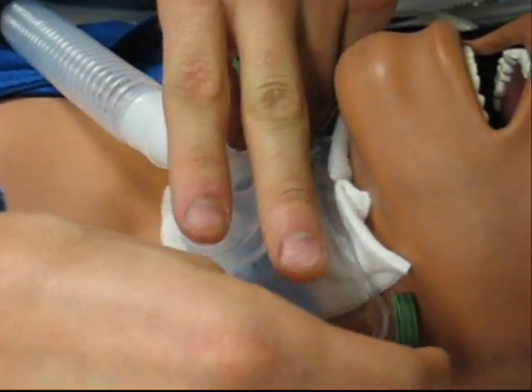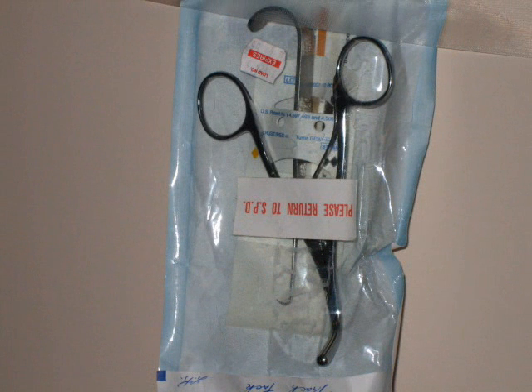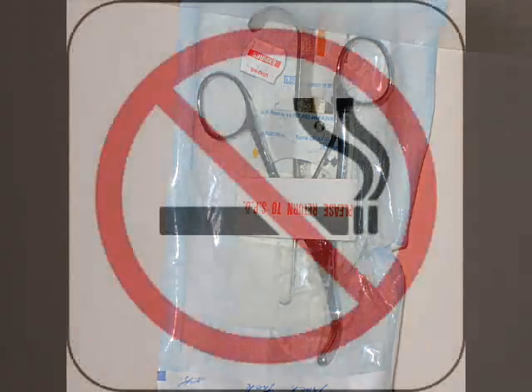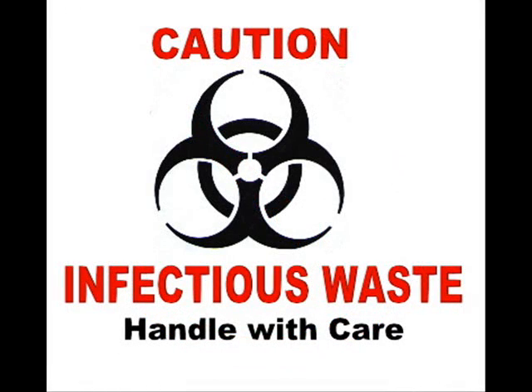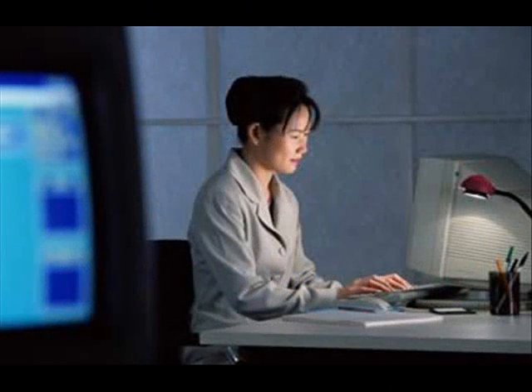Ensure patient safety and comfort while donning the tracheostomy mask, as well as ensuring that emergency airway supplies are present at the bedside. Observe the patient for any unfavorable signs and symptoms, as well as following oxygen safety and infection control procedures that may be posted.